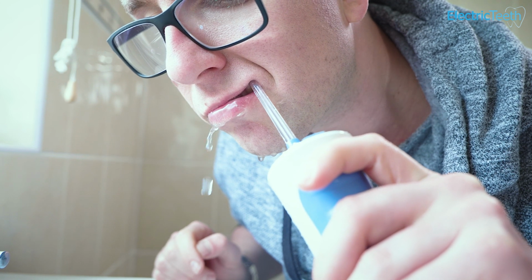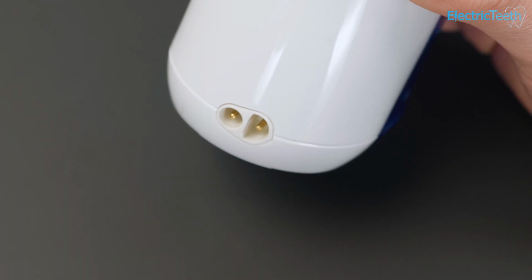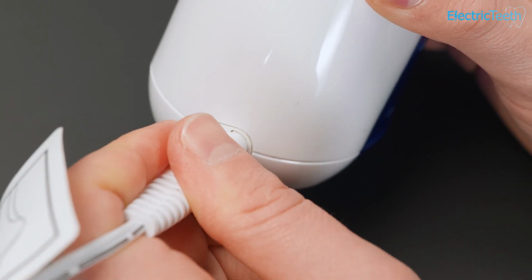So the chances of water getting in there are relatively limited, but it's certainly not impossible given the nature of the product. Water tends to run down the front here, and it is slightly recessed in there, but I can see that water may get in there and may pose some issues. It would be nice to have some form of cover on that just to give that added bit of protection to this charging port and ensure some longevity in terms of the overall performance. Now, I haven't really seen others complaining of this being a failure point per se, but it's something to be aware of.